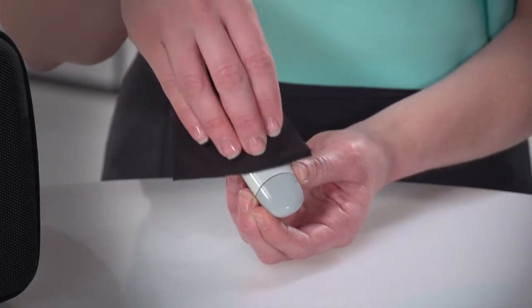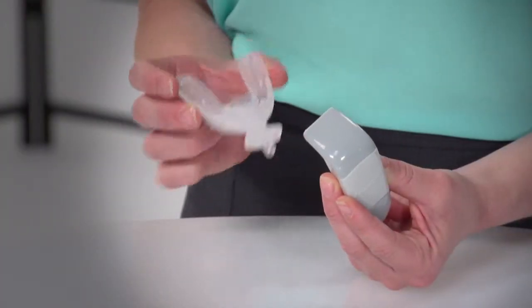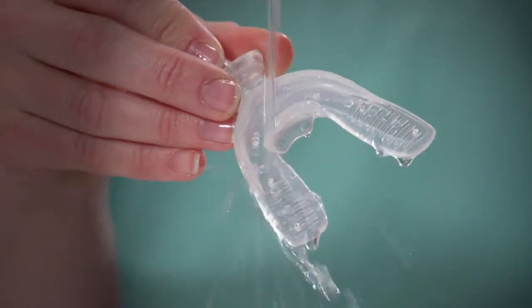Cleaning the activator is easy — simply wipe it with a soft cloth. To clean the mouthpiece, first detach it from the activator and rinse the mouthpiece in lukewarm water.